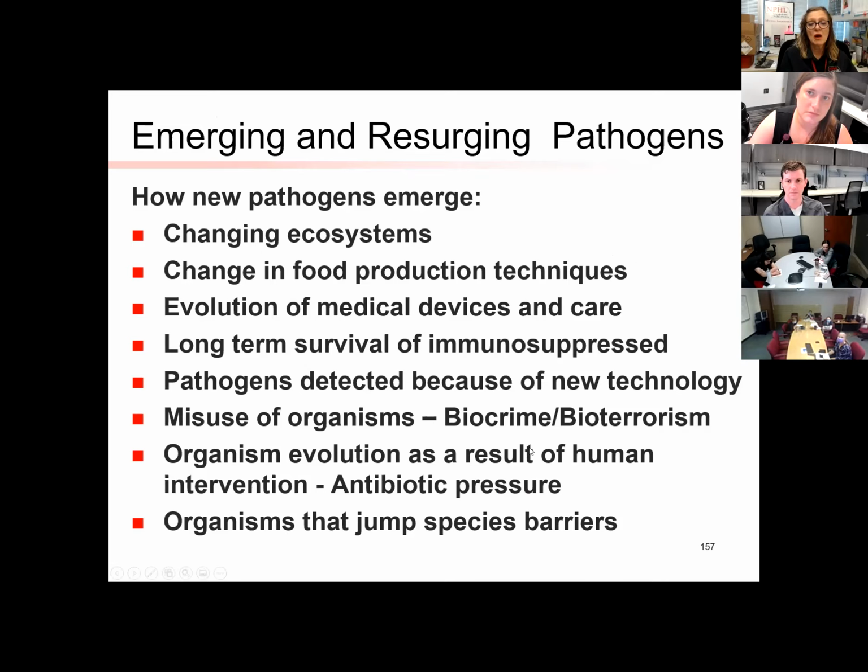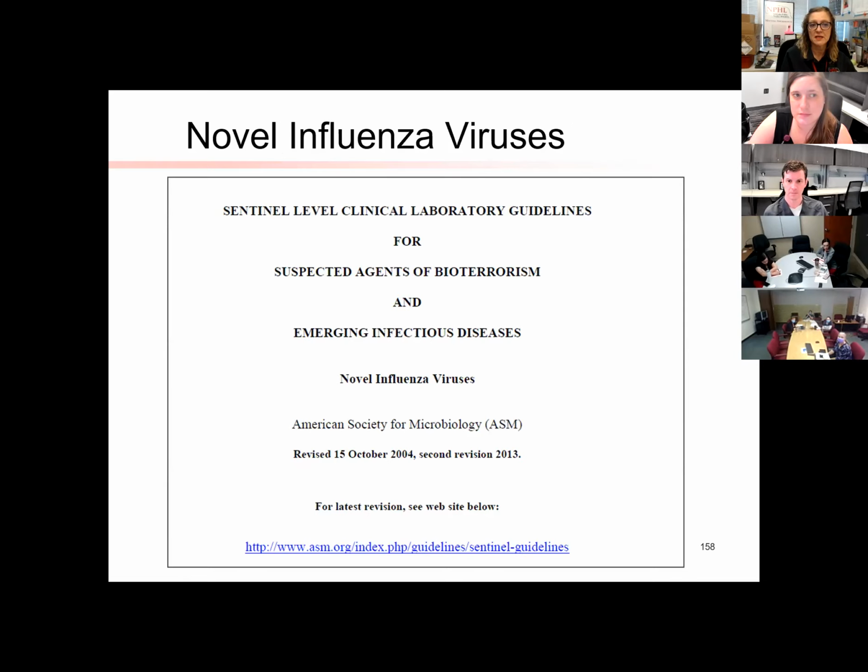So you guys are our front lines. The laboratorians are our front lines. We are depending upon you to help us to pick out these organisms and do the LRN on it. But yet we want to make it as easy as possible. We only want you to do certain biochemicals. We don't want you to go through the back charts and do every biochemical on that chart, because that'll be more confusing. Follow the protocol, follow that chart, that flow chart, to help you identify it.